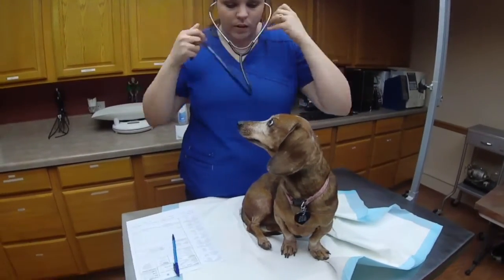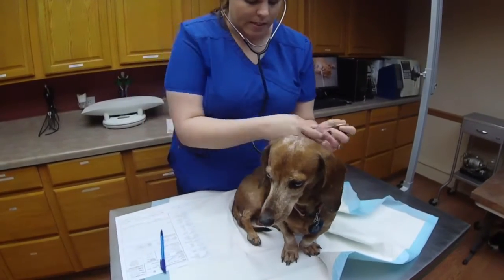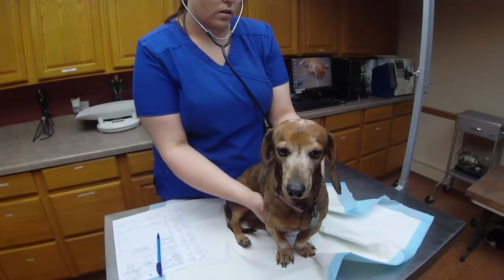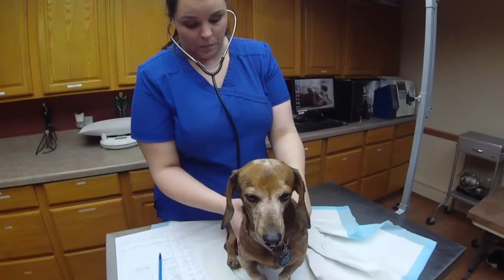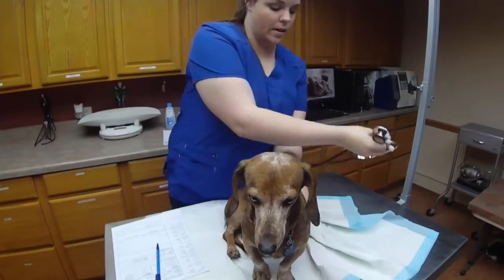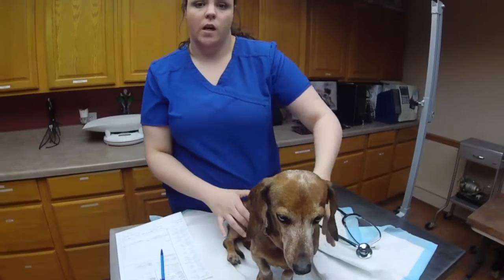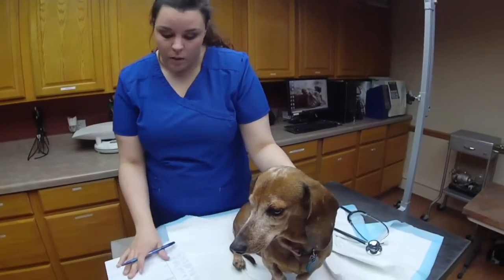So, do you need to see this first? Okay, let's listen. Oh, goodness. Okay. Her heartbeat is good. She does have a slight heart murmur on the left side, so I will make note of that.